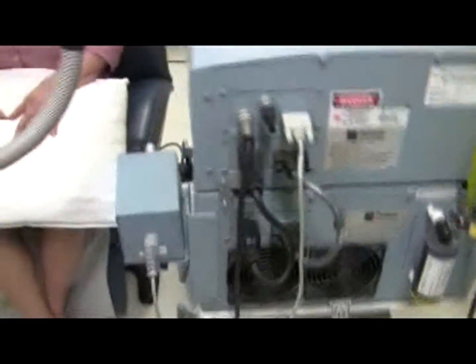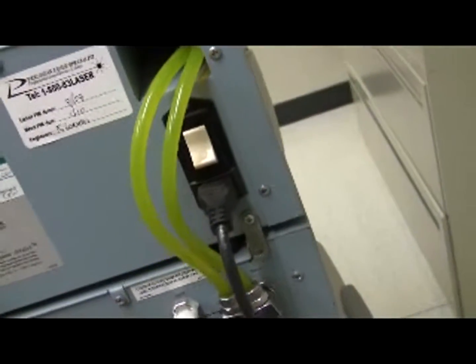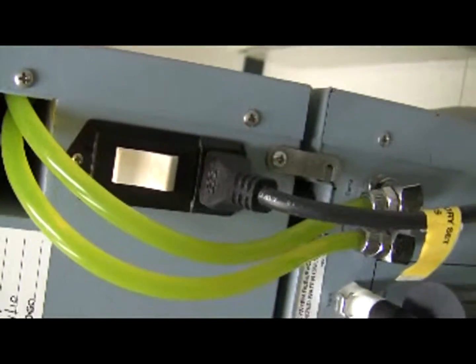Here's the back of the console. If the laser has been turned off via the power switch at the back of the console, turn that switch to the on position first. It's currently in the on position — up is on.